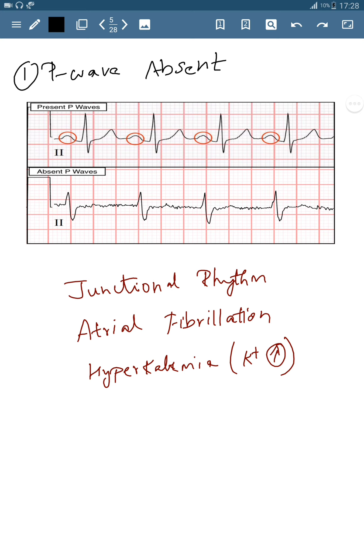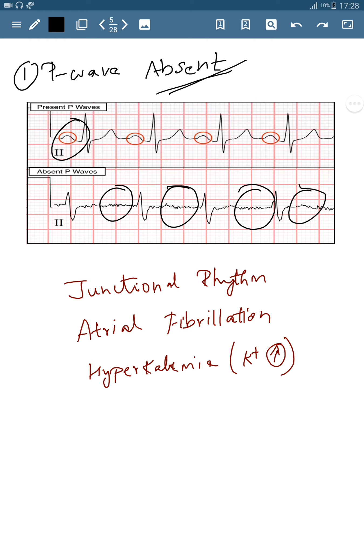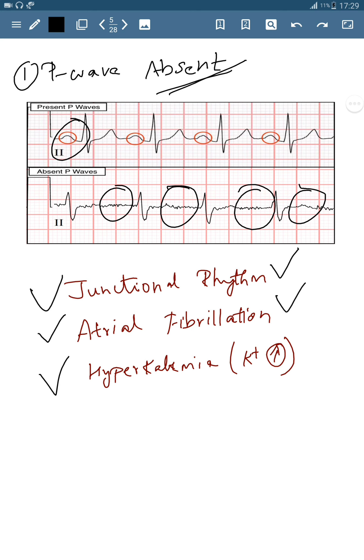When the P wave is absent, what does it indicate? You can see in this ECG the P wave is present, but in this one there is no P wave — that indicates junctional rhythm, which I discussed in the previous video. P wave absence can also be due to atrial fibrillation, which I will discuss in the next arrhythmia video, or due to electrolyte imbalance like hyperkalemia. So when the P wave is absent it indicates junctional rhythm, atrial fibrillation, or hyperkalemia.